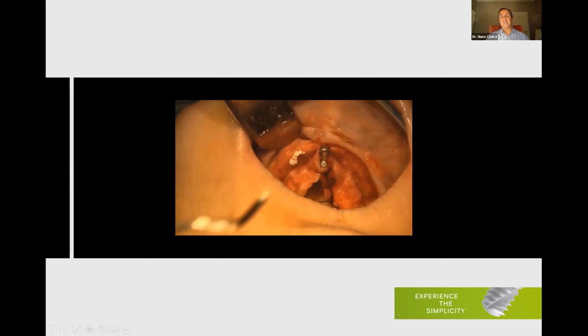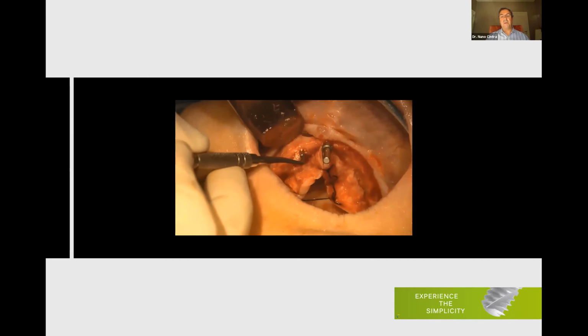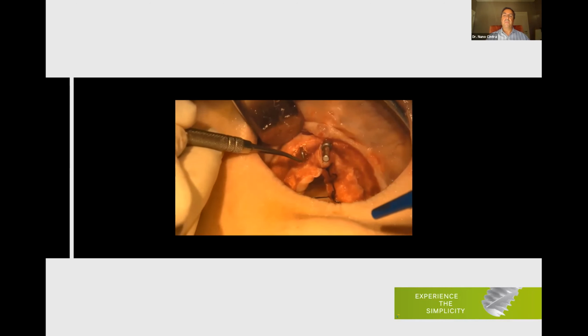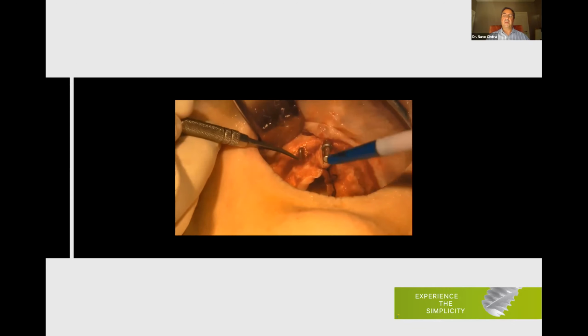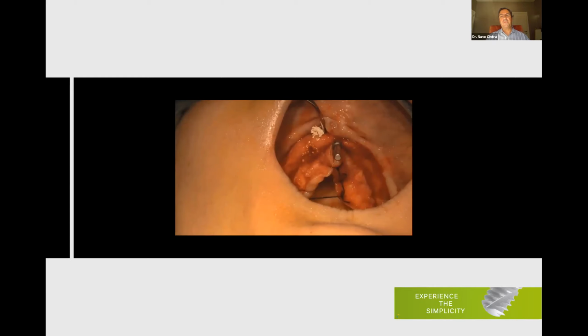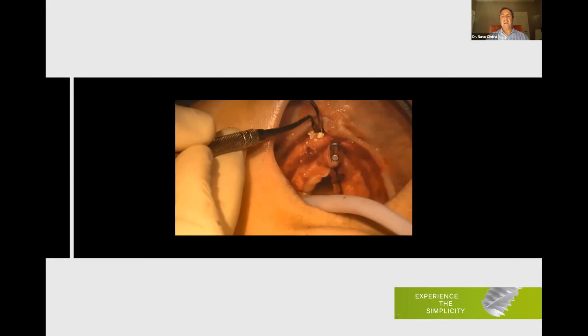In this case, I will use only tricalcium phosphate from a Portuguese manufacturer, and I start placing the material through my preparation. Okay, I push it up, all the way up, in a way that when the implant goes in, the implant will push all this material towards the nasal floor. Of course, I also fill the nasal floor. I will place my graft also on the nasal floor, enough to build a layer or a barrier between the tip of the implant and the nasal floor.